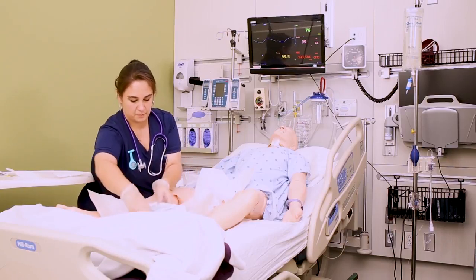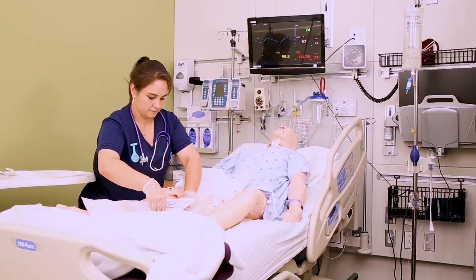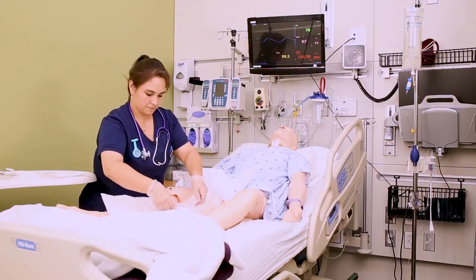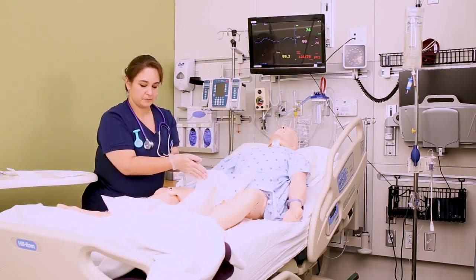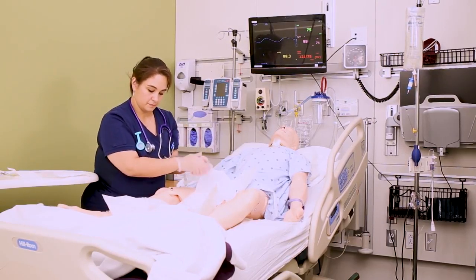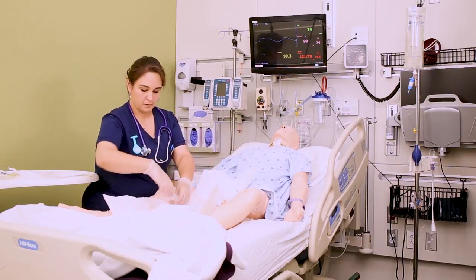Grab the plastic tray off the top of the kit, slide the kit towards the patient's feet, and pull the tray between the kit and the perineum — again, just giving yourself a nice wide place to work from.